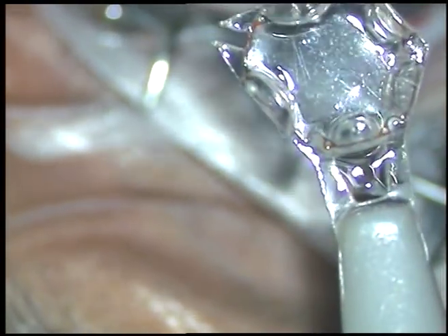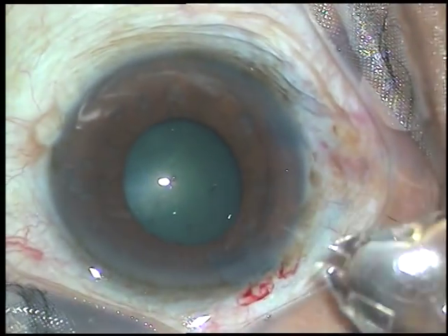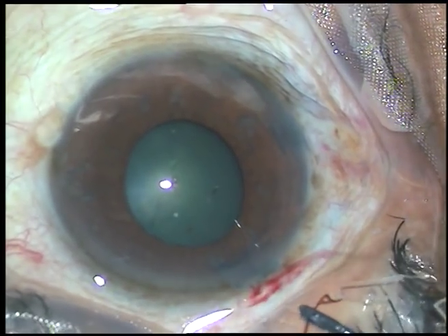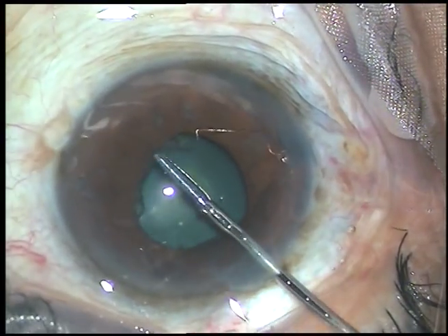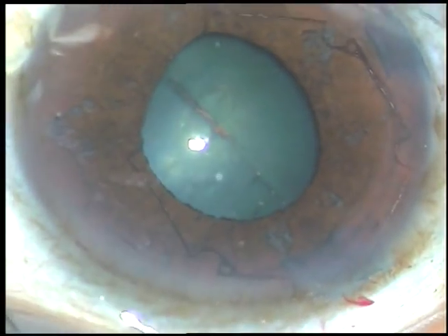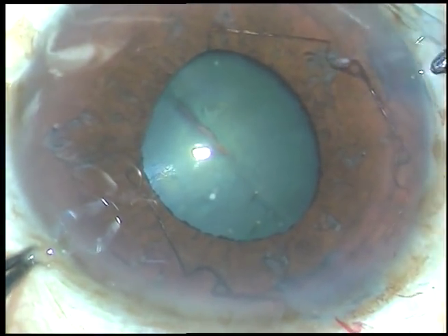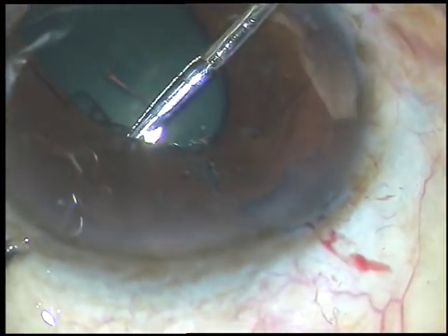Here is the BX pupil expander — it is in a nice housing. Just inject viscoelastic substance over the housing, take the recommended 23-gauge crocodile forceps which opens vertically, and introduce the BX into the anterior chamber. The whole device goes inside and you can tuck the leading flange. Now going through the right side port and holding onto the flange at 12 o'clock, tucking it gently underneath the iris.